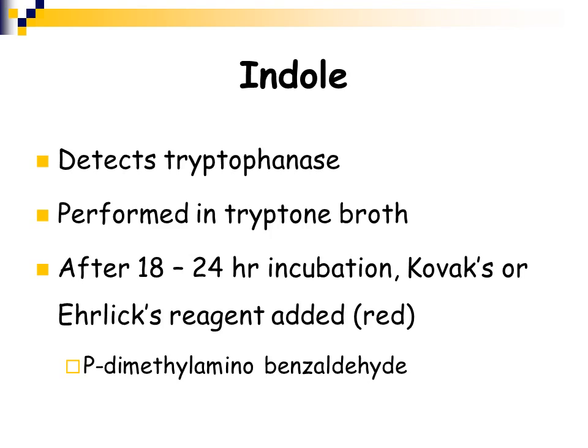For the indole test, this is a test that detects the enzyme tryptophanase, and it's performed in a tryptone broth. So you inoculate your organism in a tryptone broth, you incubate it overnight, 18 to 24 hours at 35 to 37 degrees, and you add one of two reagents, either Kovacs reagent or Ehrlich's reagent. These reagents have p-dimethylaminobenzaldehyde, and you will get a red color in a positive reaction.